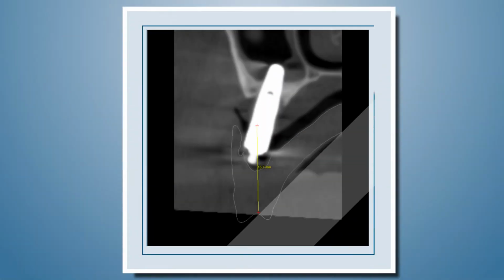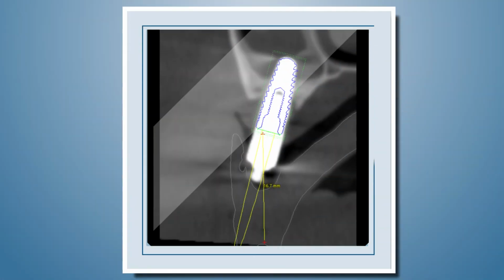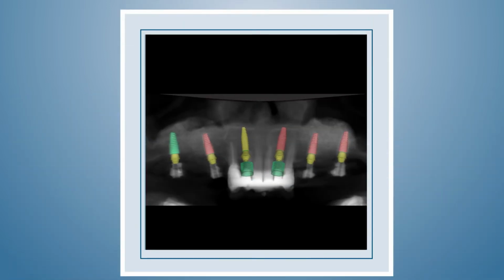Great question. From a planning perspective, we first determine whether we can utilize the existing implant from a restorative standpoint. So how much space do we have, or plan for new implants. There are two ways to utilize existing implants on fixed cases. The first is to pick up the implants at surgery. We can get an accurate positioning of the implants on the CBCT and tie them into the provisional. This is typically the simplest method of utilizing existing implants.